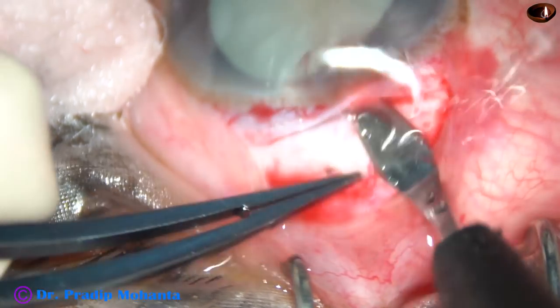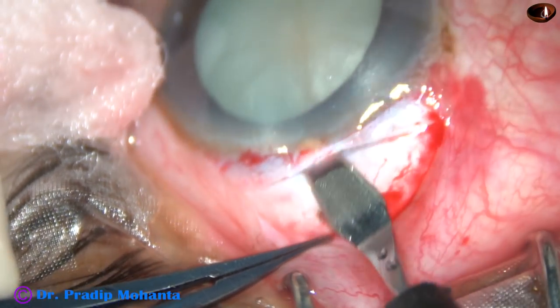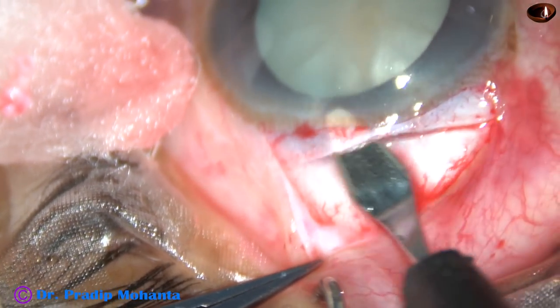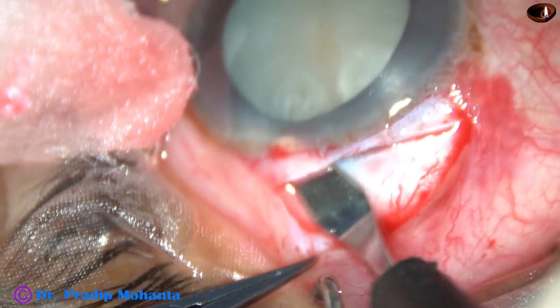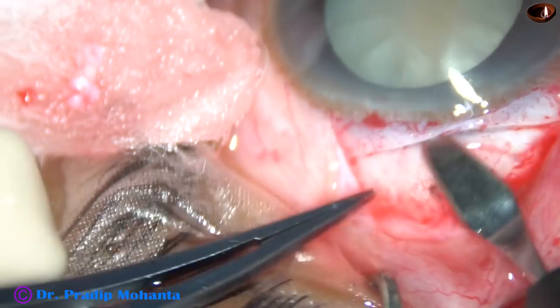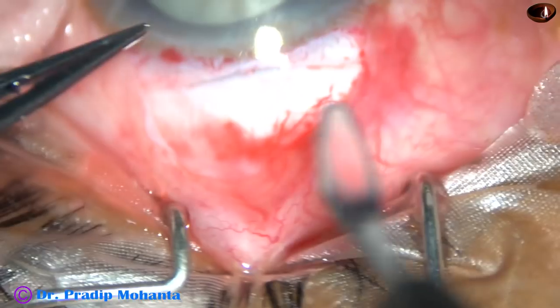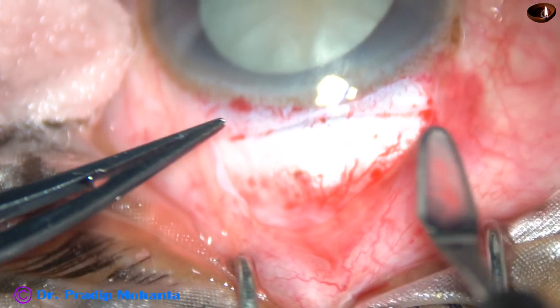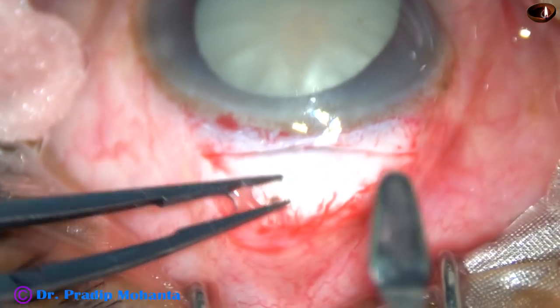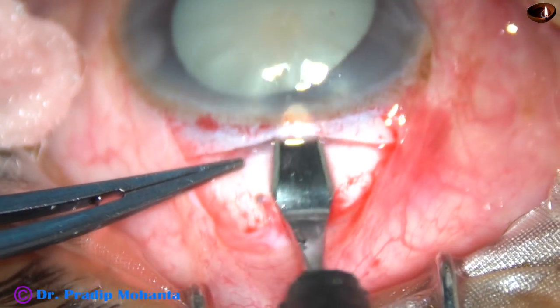A crescent blade is being used for making the sclerocorneal tunnel. The corneal length of the tunnel should be about 1 to 1.5 millimeters.